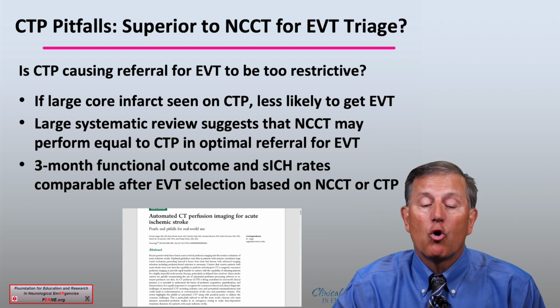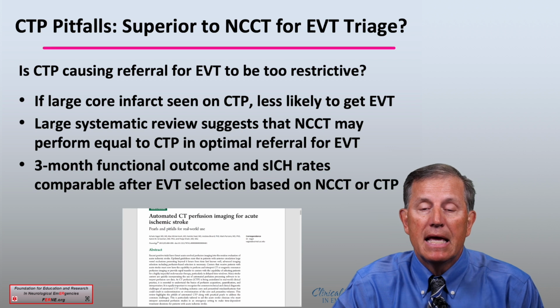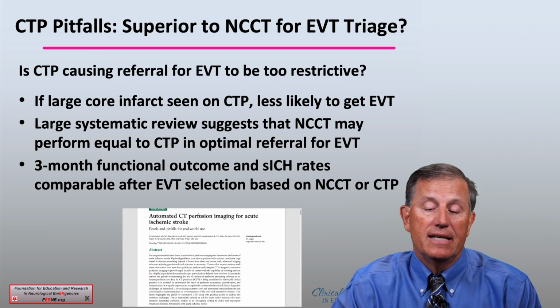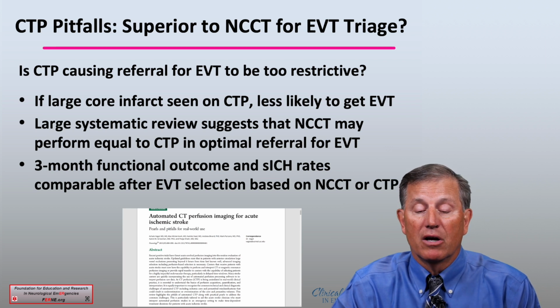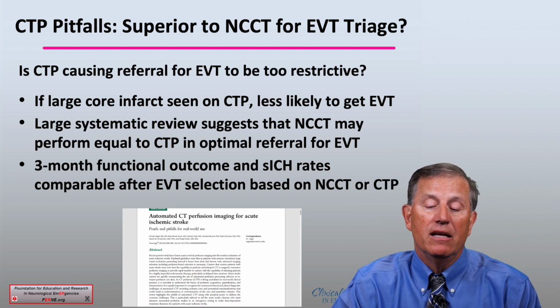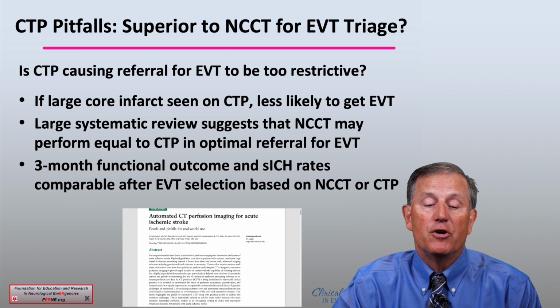We know that if a large core infarct is seen on CT perfusion, the patient is less likely to get EVT. And although this is likely the right way to approach patient treatment, it may be that we are restricting the number of patients who should go for EV therapy. And a large systematic review listed here does suggest that a non-contrast CT may perform equally well to CT perfusion in the optimal referral for EV therapies. In fact, the 3-month functional outcomes and symptomatic intracerebral hemorrhage rates were comparable in patients who received EVT based on selection with simply a non-contrast CT or CT perfusion.